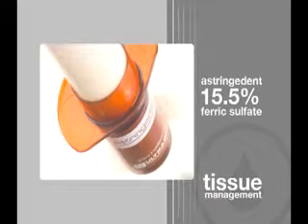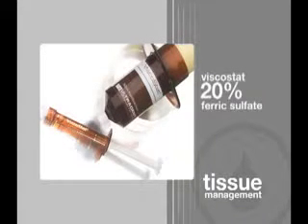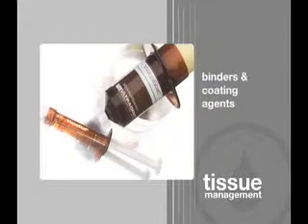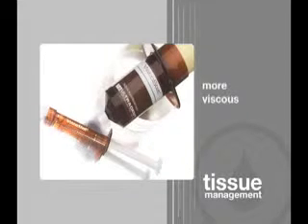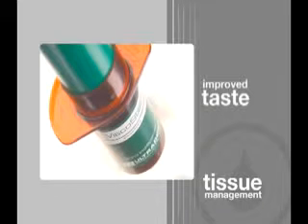Astringent is a 15.5% ferric sulfate solution and was ULTRADENT's first hemostatic agent. Viscostat is a new and improved version of Astringent. It's a 20% ferric sulfate coagulative hemostatic gel with binders and coating agents to make it kinder to tissues. Viscostat is also more viscous, which makes it easier to control. ULTRADENT also offers Viscostat Winter Mint, a mint-flavored version of the original Viscostat formula that offers an improved taste for the patient.